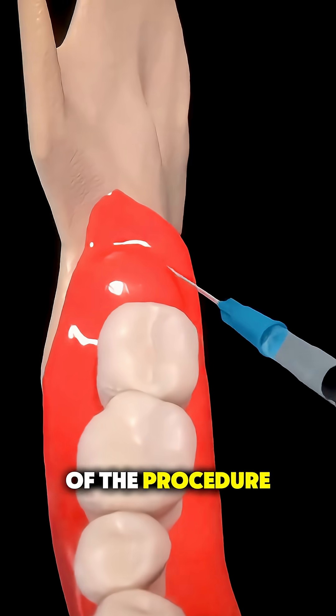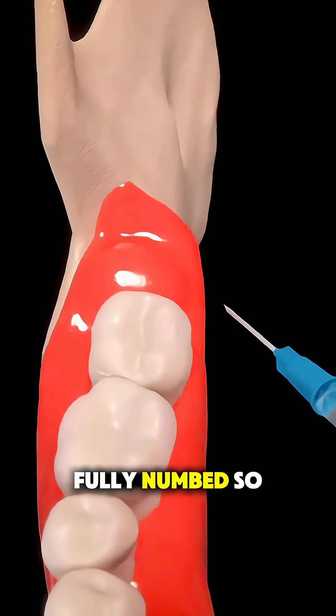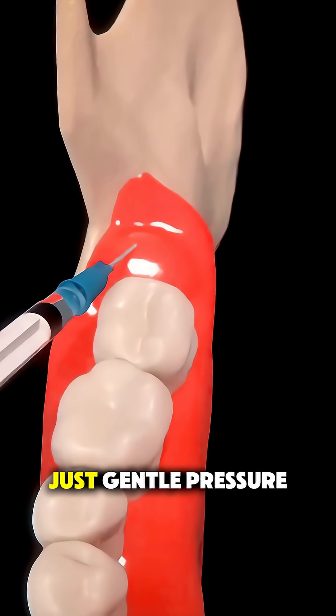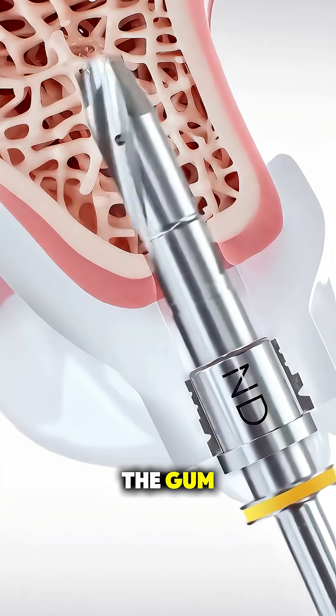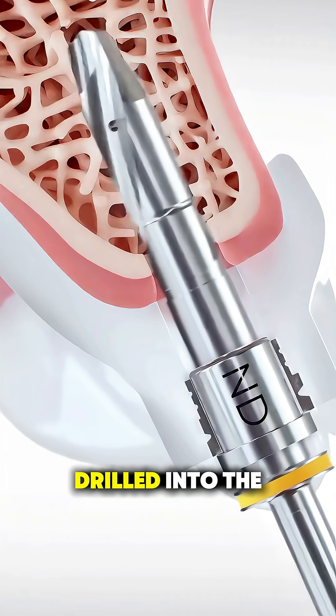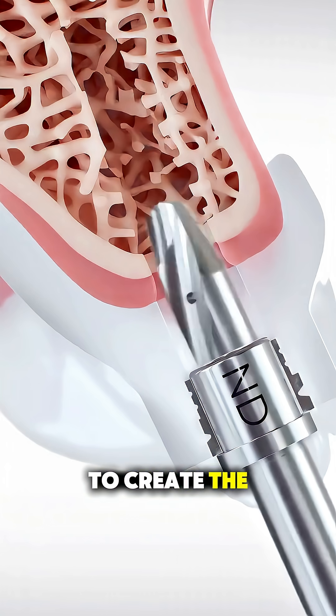On the day of the procedure, the area is fully numbed, so you won't feel pain — just gentle pressure. A small opening is made in the gum, and a tiny hole is carefully drilled into the jawbone to create the implant site.